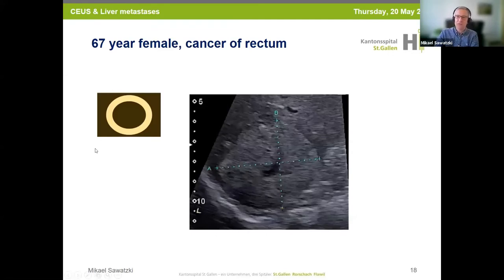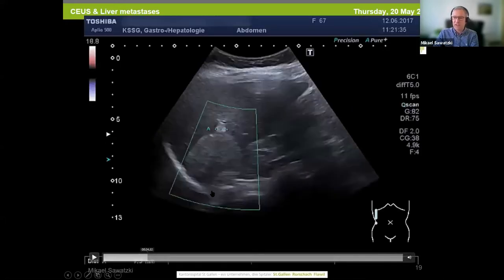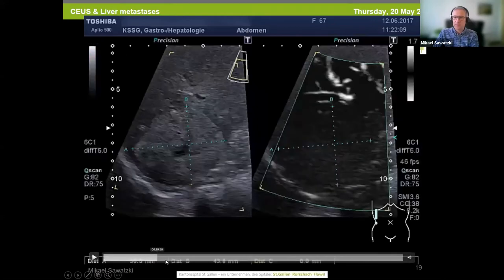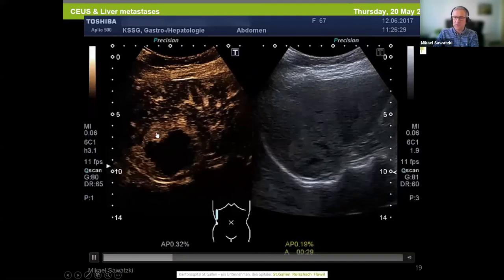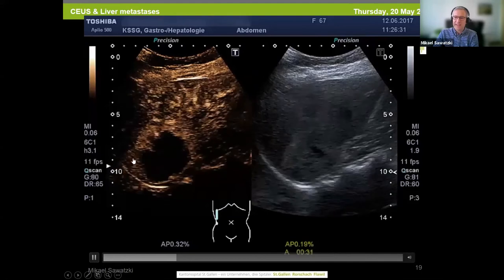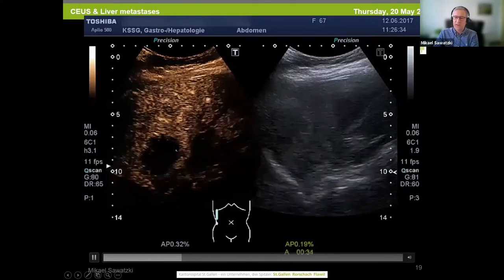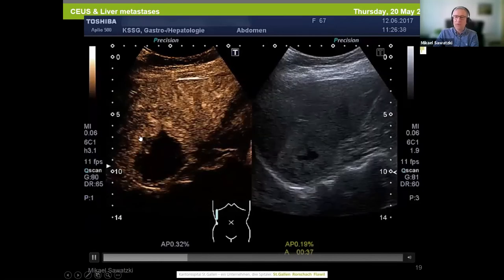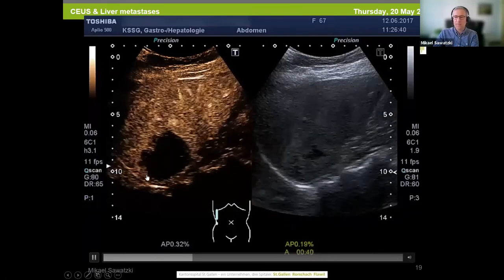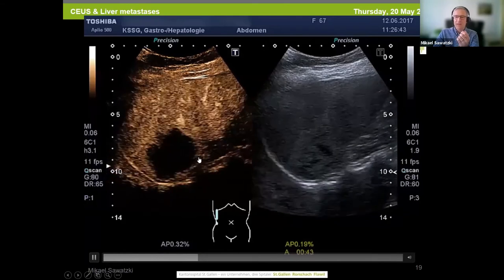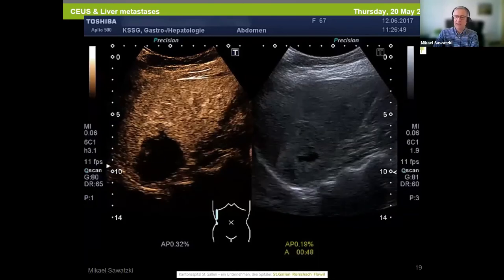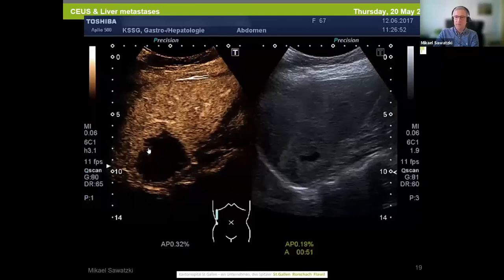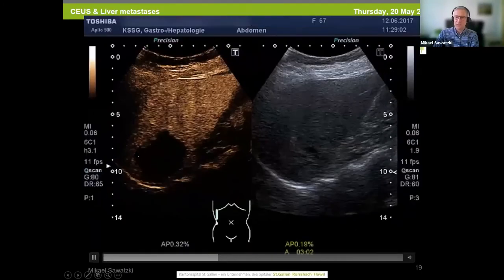This is an example of rim enhancement in liver metastasis. A 67-year-old patient with cancer of the rectum. You see a hypoechogenic liver lesion with a satellite lesion, about 6 cm. You see hyper-enhancement at the edge of the lesion — the rest is necrotic. You have to pay attention not to miss the washout at the edge. You can measure the diameter in the arterial phase, and in the late venous phase you will see the diameter increase and then washout becomes apparent.